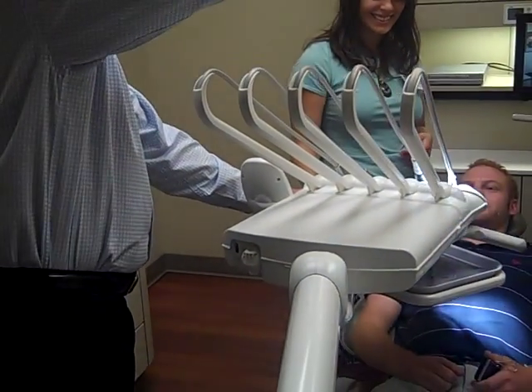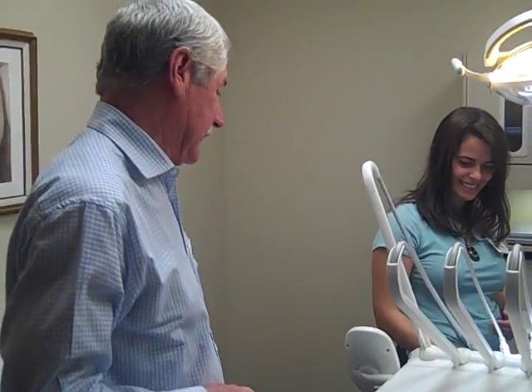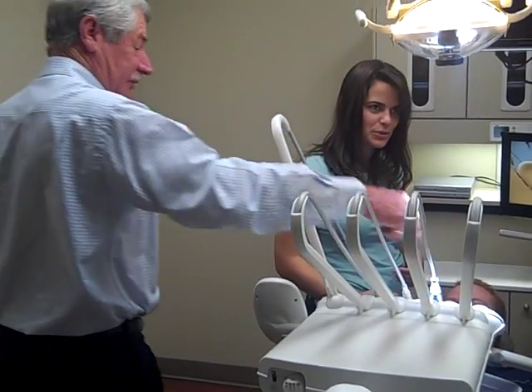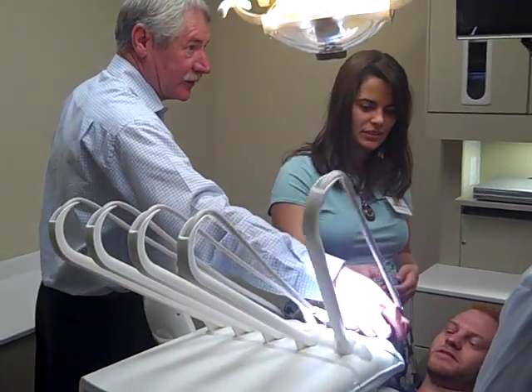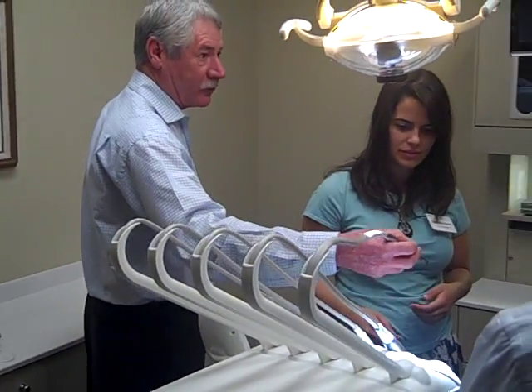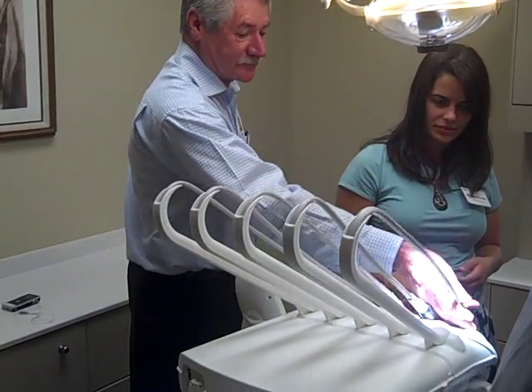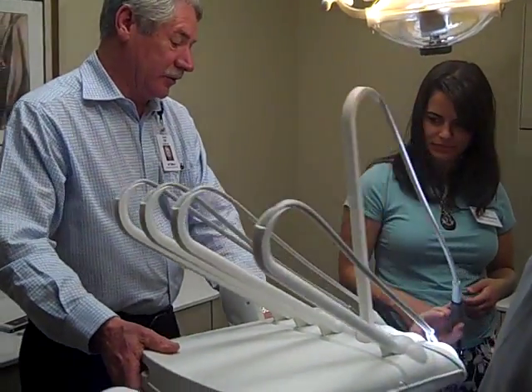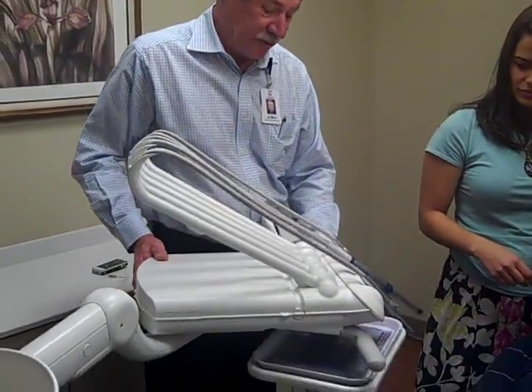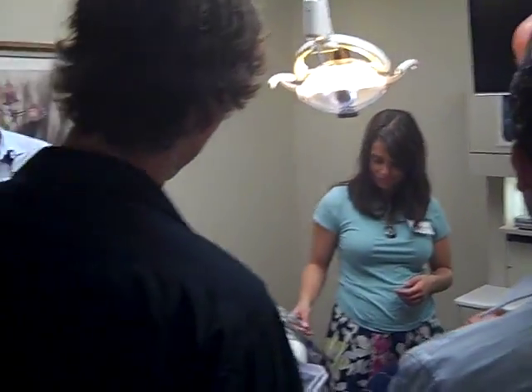Do you? Yeah. So you've got less strain or less pullback on your hands. I like that. In the syringe, it's exactly the same way as you would pick up your handpiece. Right. So you can use thumb or forefinger. That makes so much sense. Can you put it up or lower? Yeah, it does. But some people don't like it. There's something you can use in this sort of position here. So you still get less pullback on your arms and wrists. There's only one action.